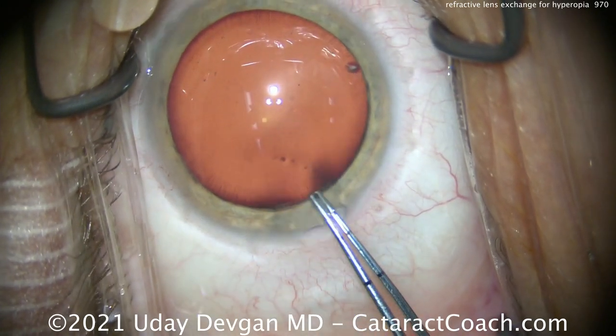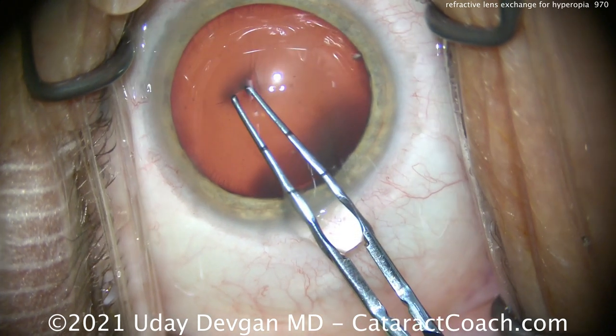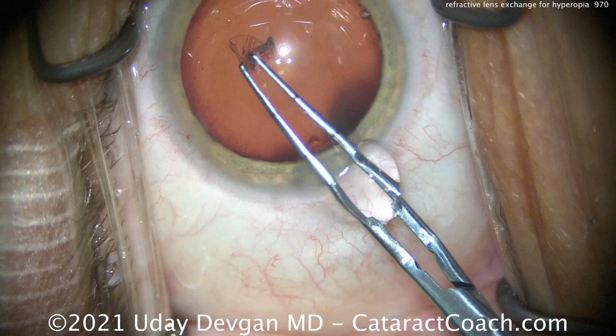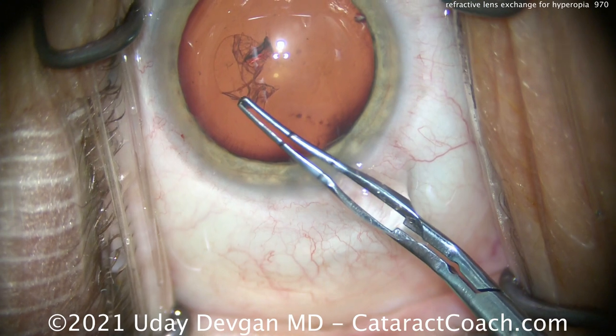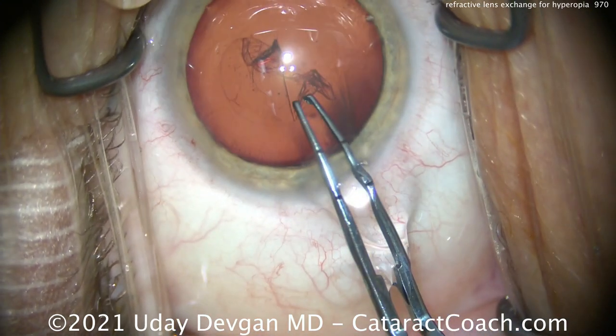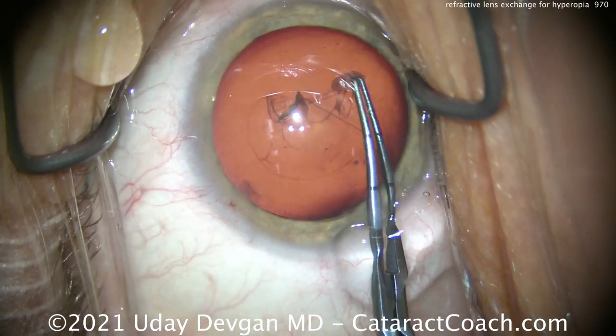That's very important to be able to create the capsulorrhexis. For capsulorrhexis creation, we'll measure out and get that 5mm diameter in mind. Visualize that, and we'll start with the rexis. But look how we still lose some viscoelastic out of the main incision, and as we do the capsulorrhexis, it has a tendency to want to run outward.